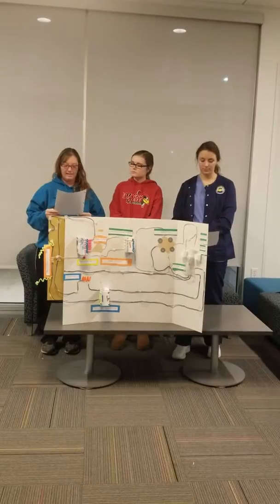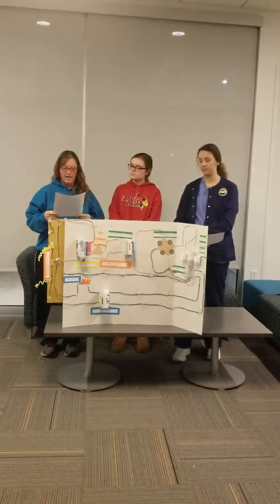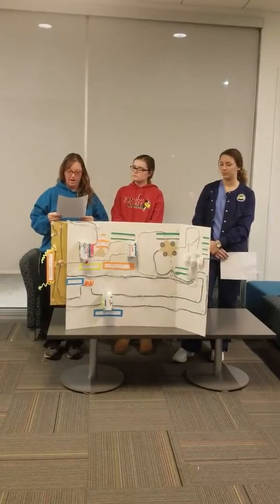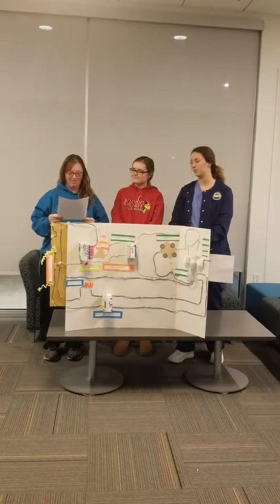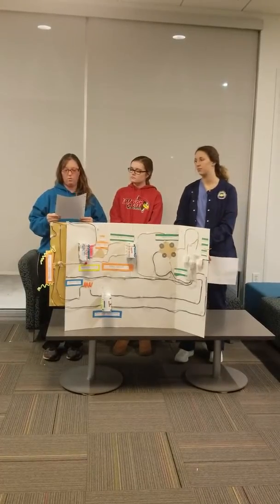One half of the AC cycle flows through the X-ray tube, and the other half, which would otherwise flow through the X-ray tube the wrong way, is suppressed. This type of waveform is called half-wave rectification. When four rectifiers are used, full-wave rectification is achieved. Rectifiers are one-way valves and are necessary to route the electricity through the X-ray tube correctly.